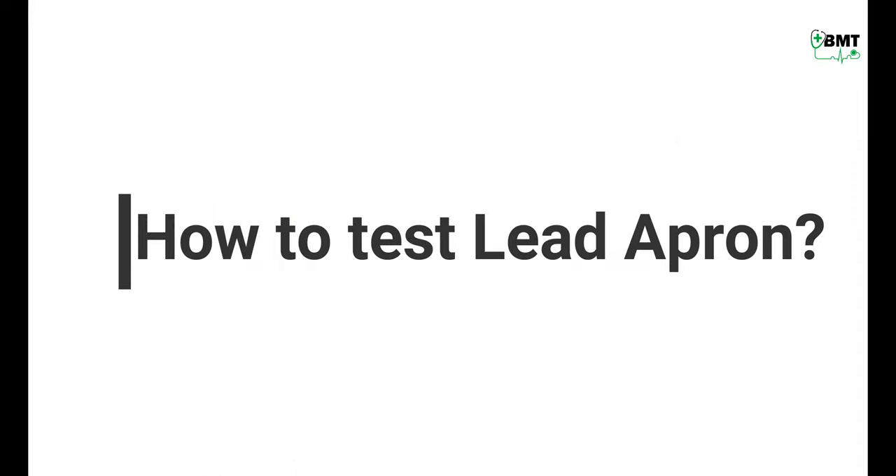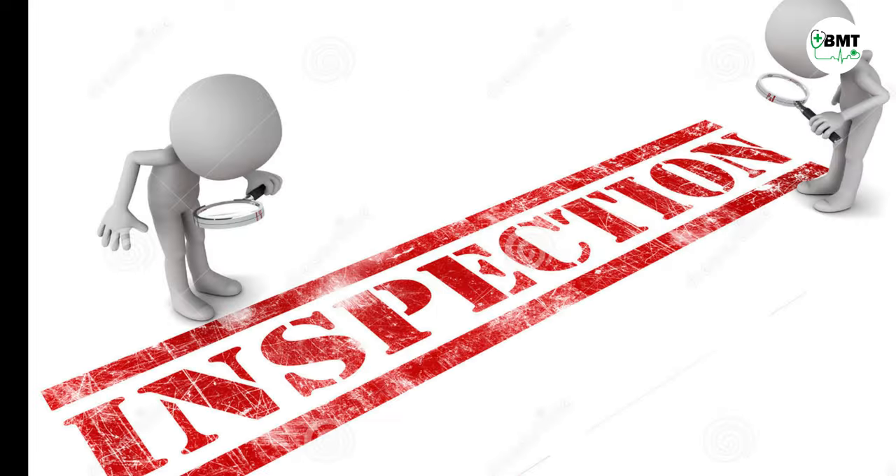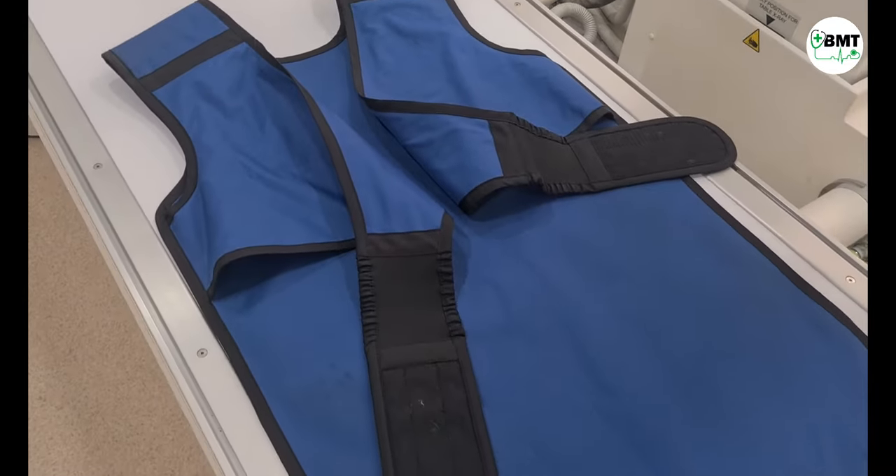How to test lead aprons? Checking should be done every six months. For visual inspection, lay them on a flat surface and check the outer and inner covers for any damage.